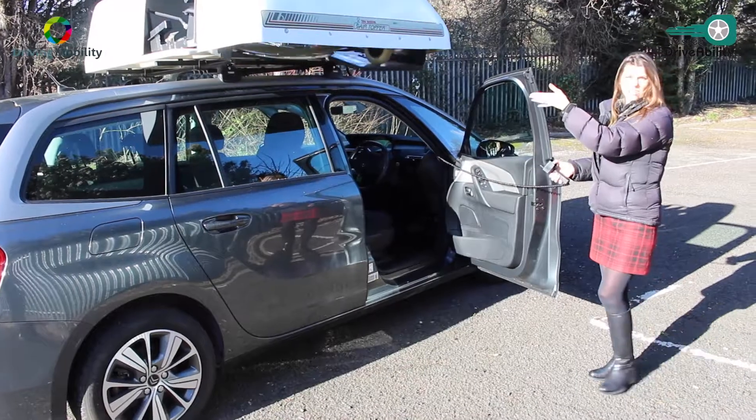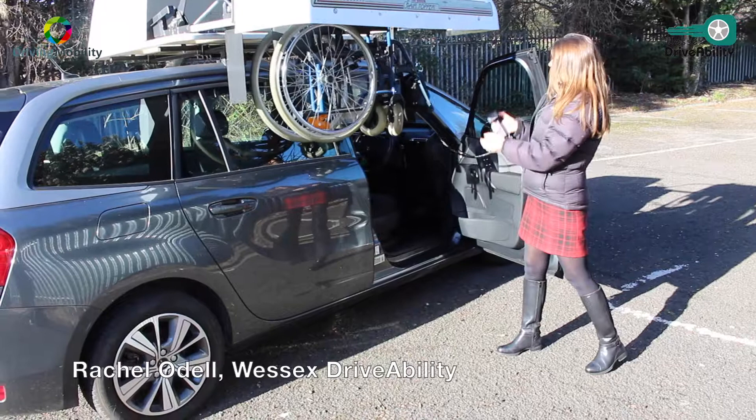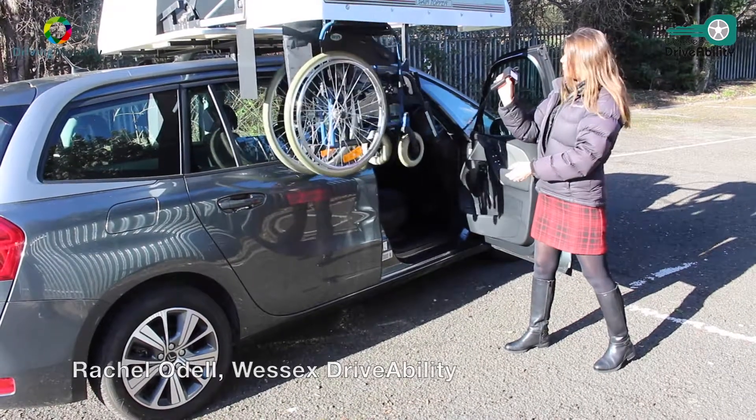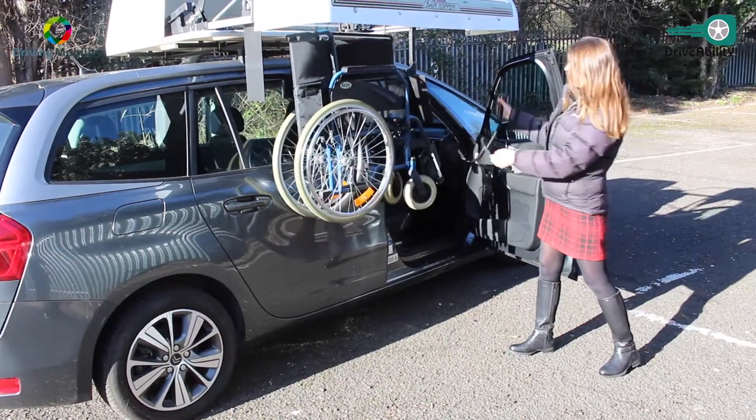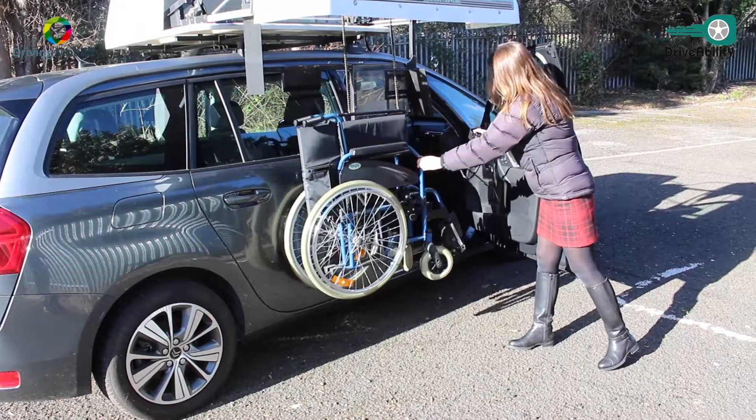This is the Brawn Chair Topper, a wheelchair storage solution. It's operated on a remote control which can be done from the driver's seat of the car. If it's raining, you can sit inside.